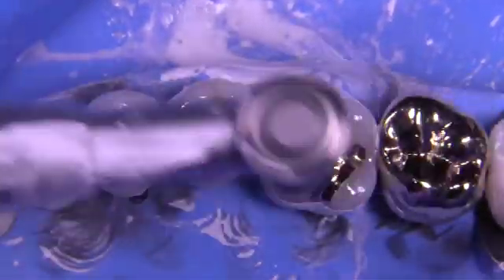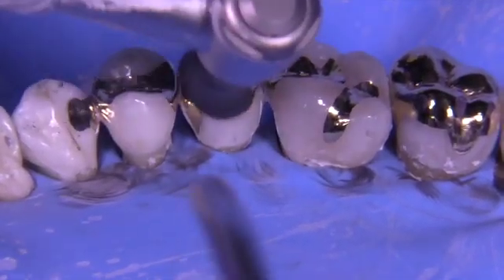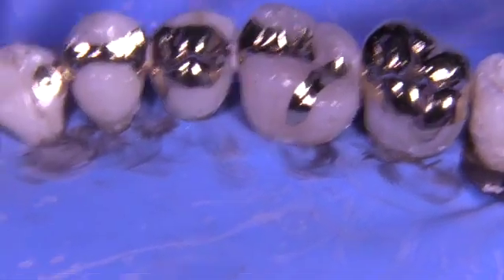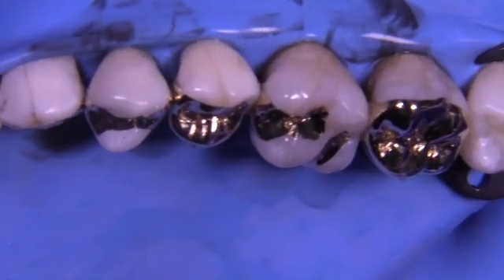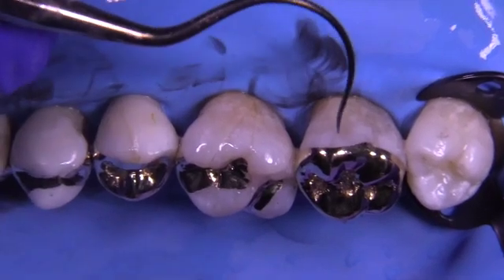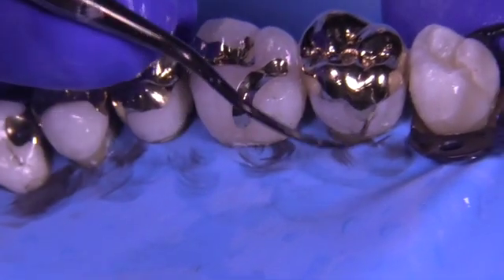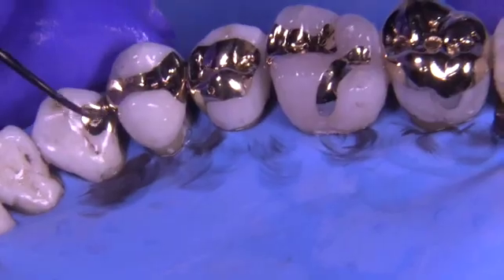Well-placed inlays do not fracture teeth. If you think an inlay is a wedge that causes fractures, you're lacking enough information on the topic. A lot of those textbook comments are based on flawed or empirical findings. Precision castings made to fit the tooth well are actually remarkably supportive of tooth structure and provide strength and durability. If inlays are not done properly — maybe the gold was expanded too much or technique isn't followed carefully — they can cause fractures, but so can composites and amalgams. It's just a matter of following the protocols taught in cast gold courses.